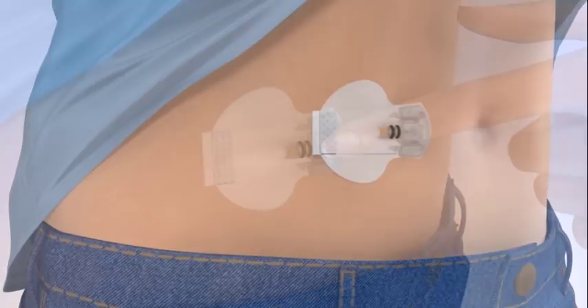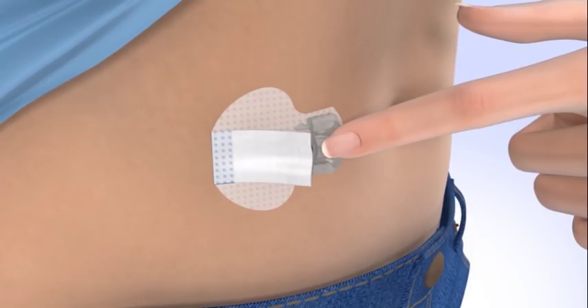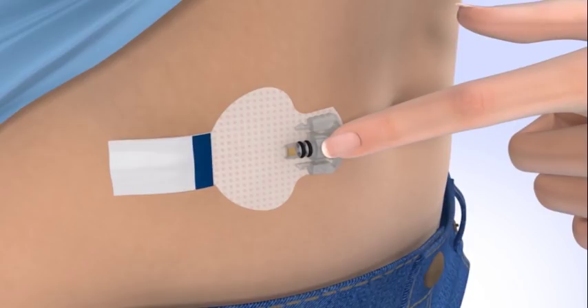Carefully remove the adhesive liner that is located underneath the curved adhesive pad and press the adhesive pad against the skin. Now, flip the adhesive tab so that it lies flat against the skin, but do not remove the adhesive liner from the tab just yet.